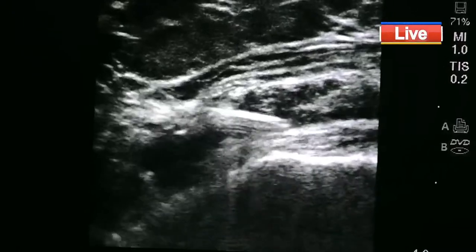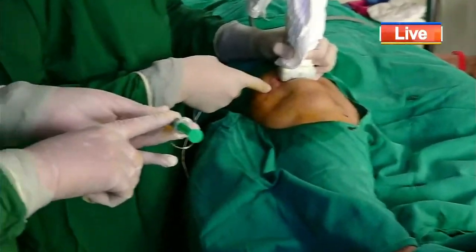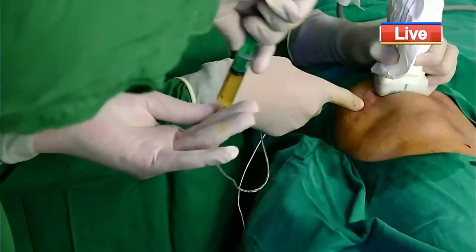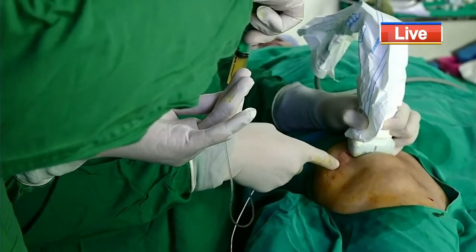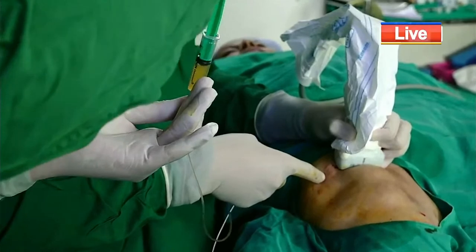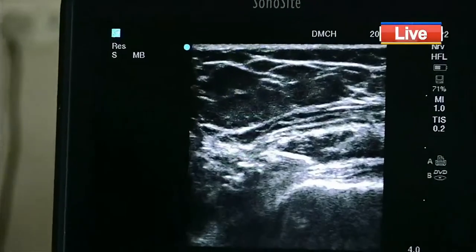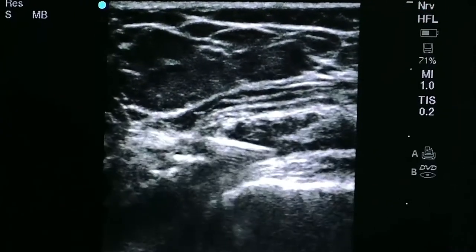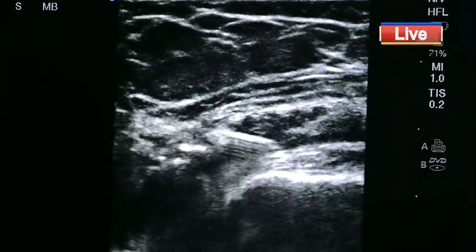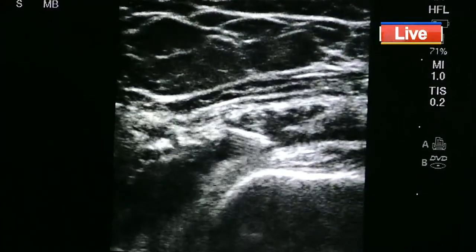Now what I'm going to do is inject this PRP which is prepared. You can see we aspirate. Press a little more, and show there again. The key here is that now push. We are going to push all these 3-4 cc whatever we have, but there's not going to be any major swelling. You hardly can make out any difference.